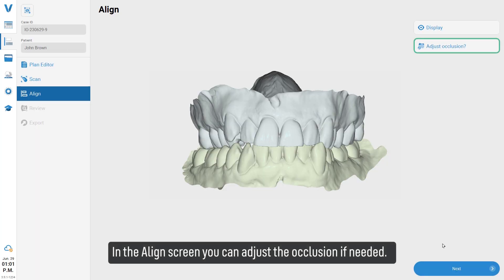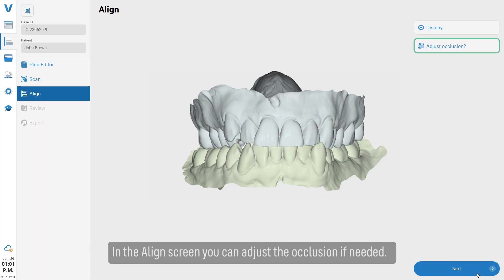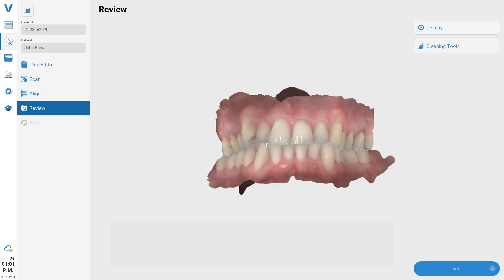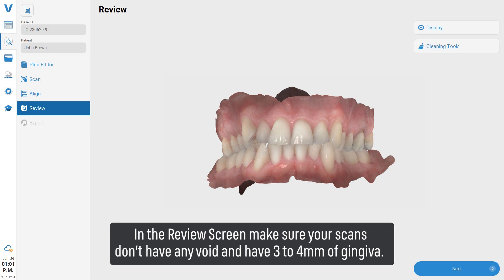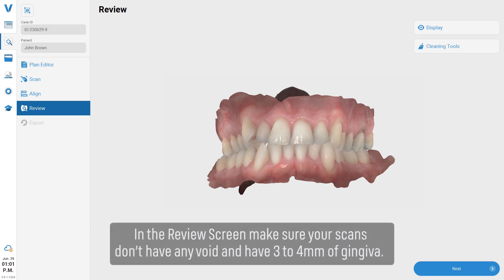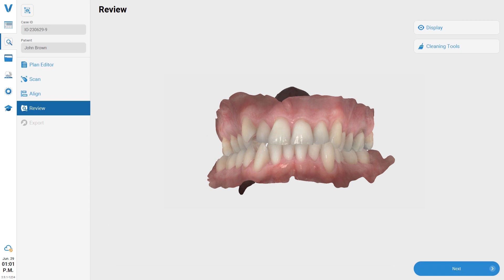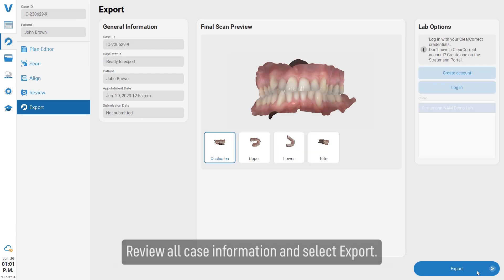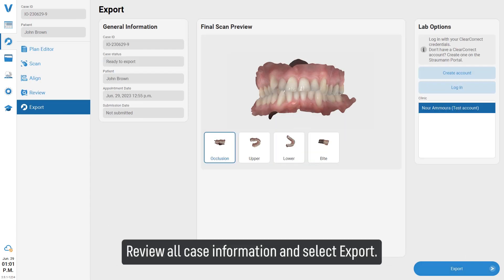In the Align screen, you can adjust the occlusion if needed. In the Review screen, make sure your scans don't have any voids and have three to four millimeters of gingiva. Review all case information and select 'Export.'